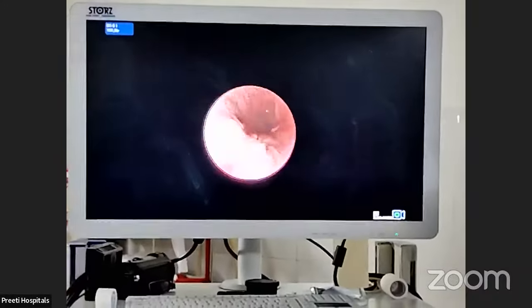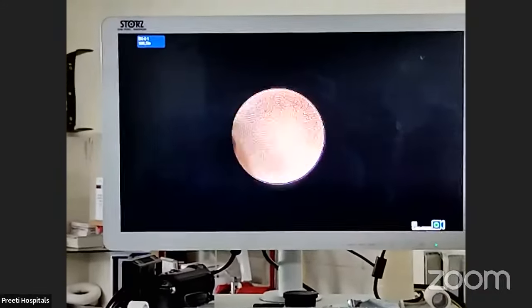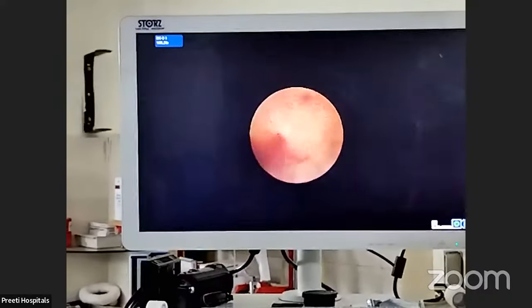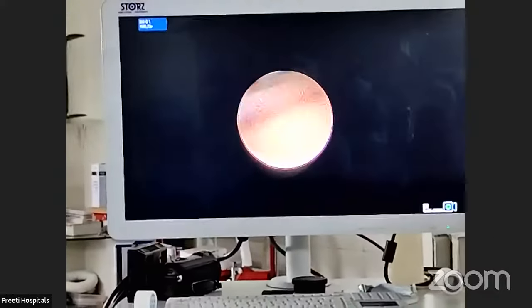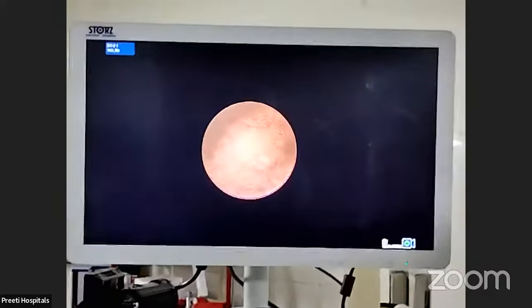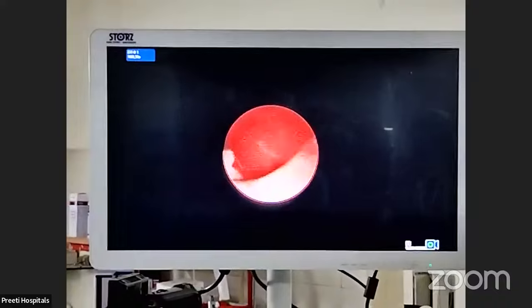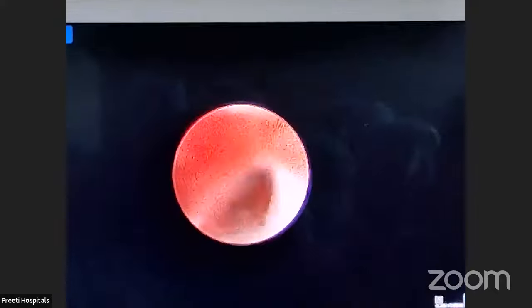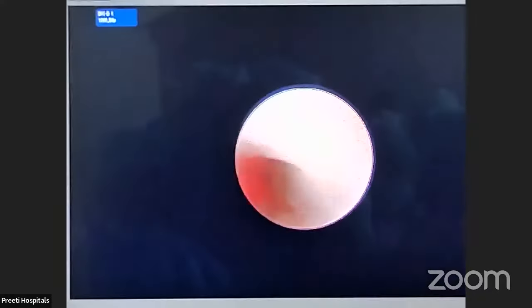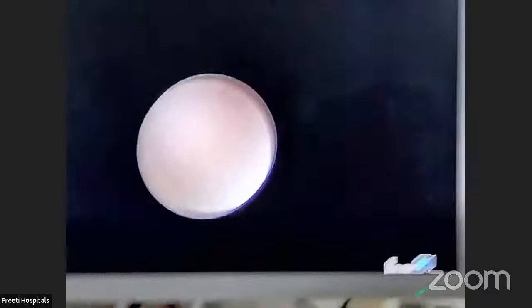Now see, when I am doing ureteroscopy, we will go inside the ureter. Can anybody take my phone and say that I am in the surgery. Now I will go inside after the stent removal, on the left side. Now this is the ureter. This is the disadvantage of the stent removal. I am going into the ureter. It is nicely dilated because of the stent. I am going inside. It is nicely dilated.